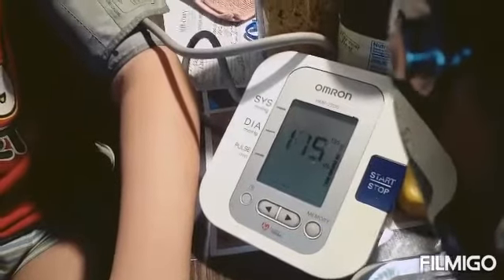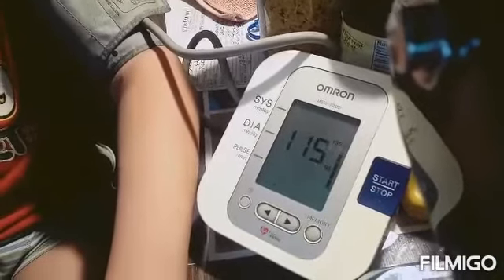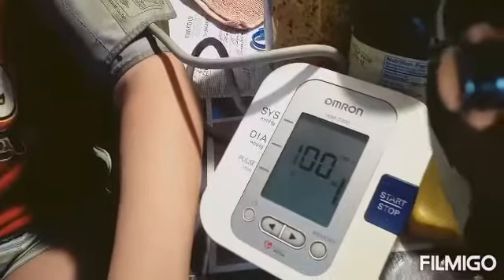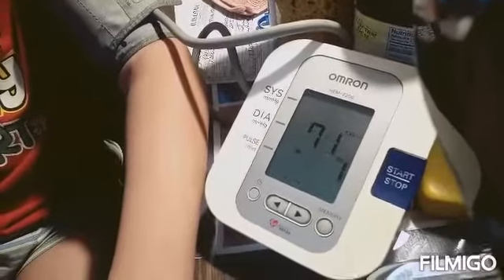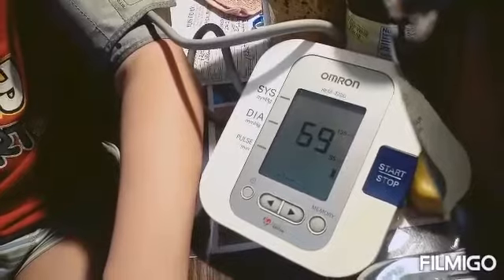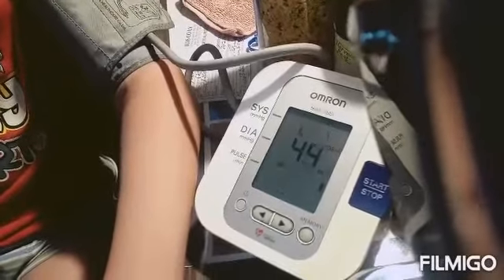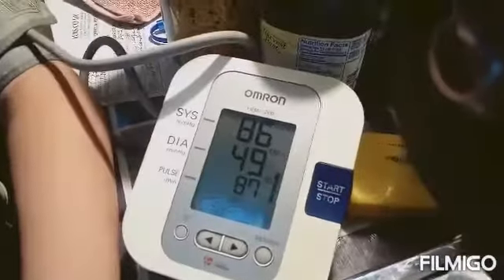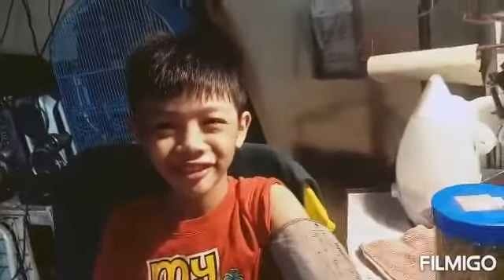The normal blood pressure of his age is 112/73. His systolic must range between 97 up to 112. His diastolic must range between 57 to 71. The reading of his blood pressure is 86/49. Maybe Nathaniel is not that relaxed today.